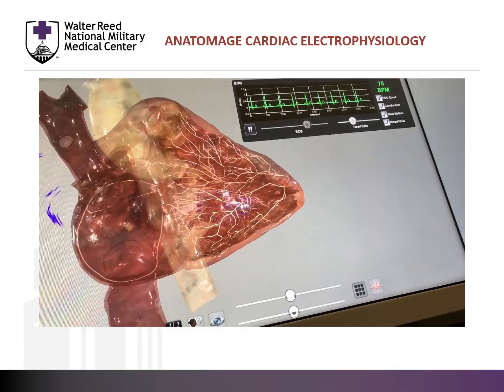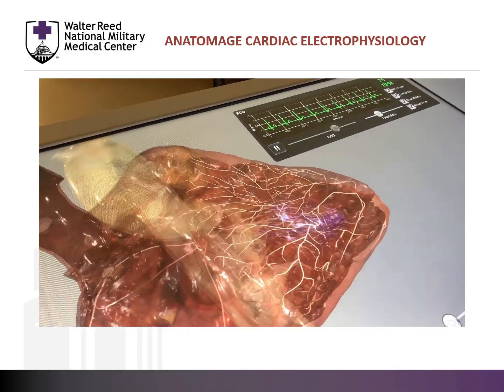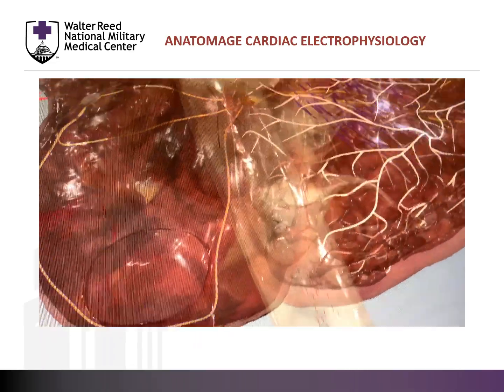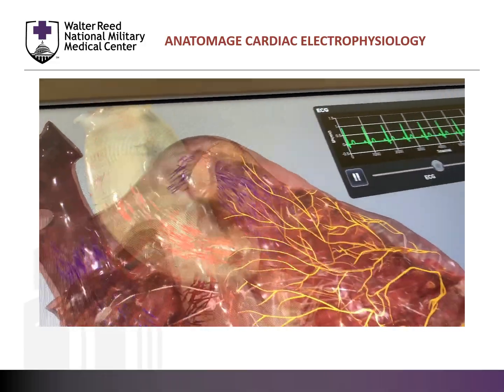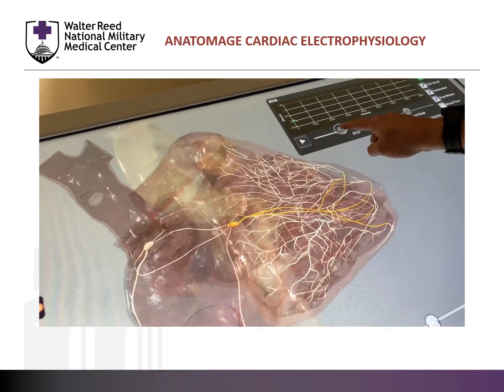Here we see how the cardiac anatomy, electrophysiology, translates to the EKG findings that we see clinically. First, we trace the deoxygenated and oxygenated blood through the chambers and the great vessels.